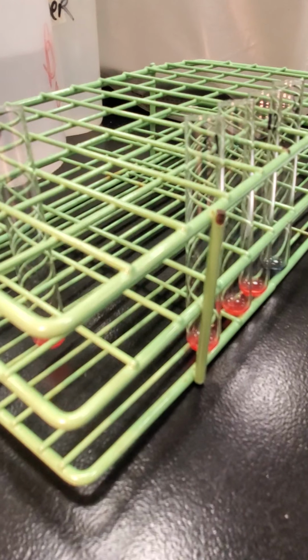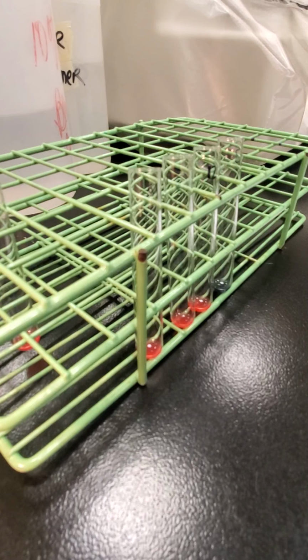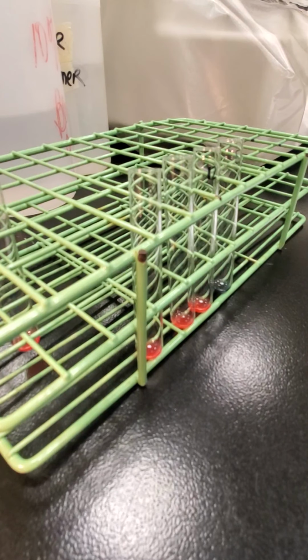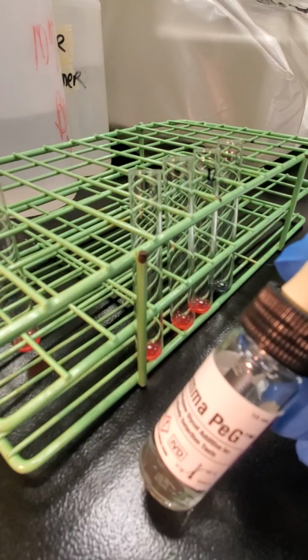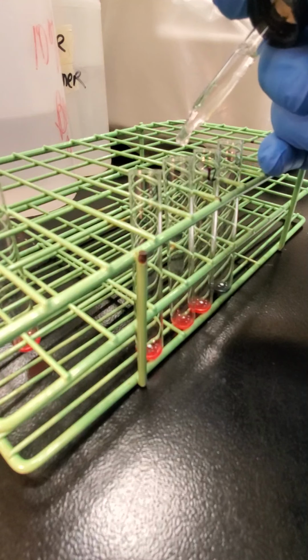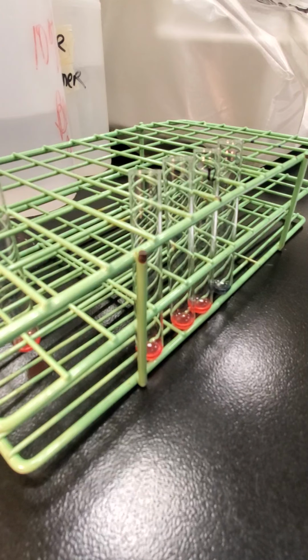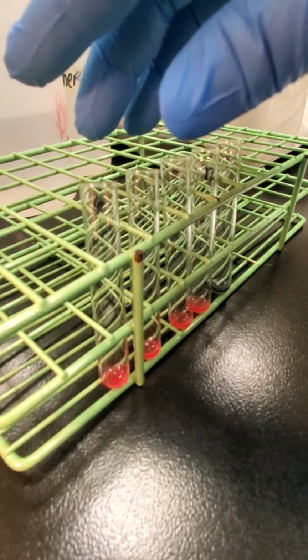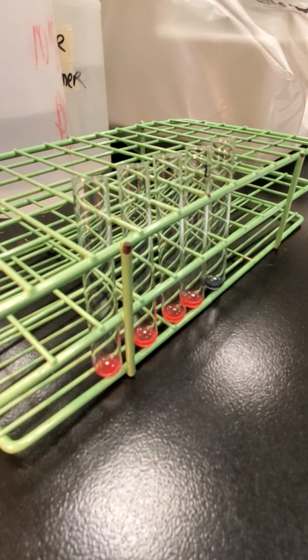And then 10, 11, 12, and 13, we are going to continue with warming those at 37 degrees, so with an enhancement, just like our antibody screens. So we're going to add PEG, our enhancement, 2 drops. Okay, and then I'm going to include tube 6 that does not have any enhancement. I'm going to put these in the heat block for 15 minutes, and then I'm going to wash these 4 times.